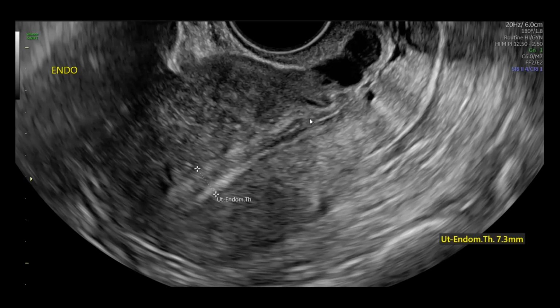Drawing your attention up to the cervix, we do have a few Nabothian cysts here. These are not anything to be concerned about. I do not report them unless they're very large, and that usually would be something like more than 3 centimeters maybe, only insofar as to help prevent future distraction or chaos. If somebody else scans and says that there is a cystic lesion present and they're not quite familiar with a Nabothian cyst, maybe there's going to be an accidental overcall or a bit of concern created for no reason. So I want to document that.